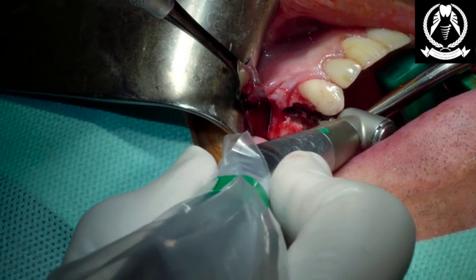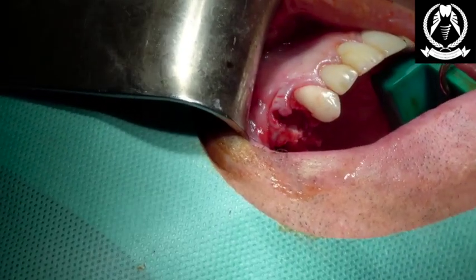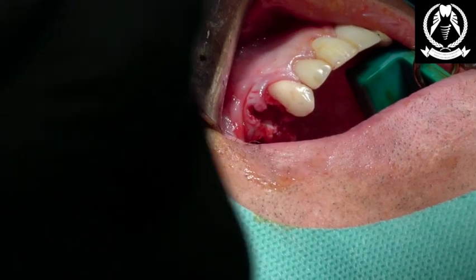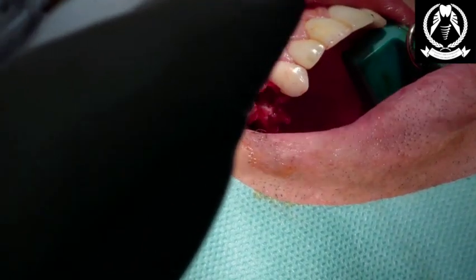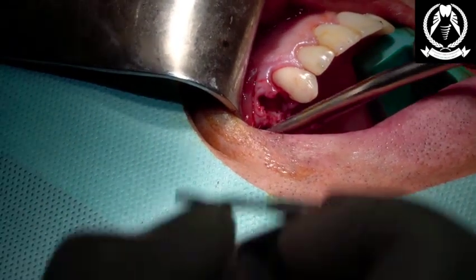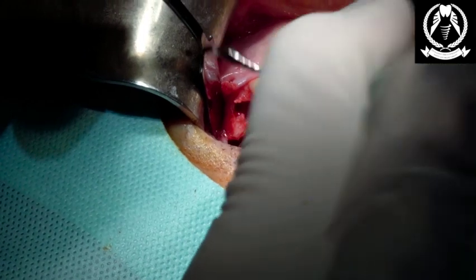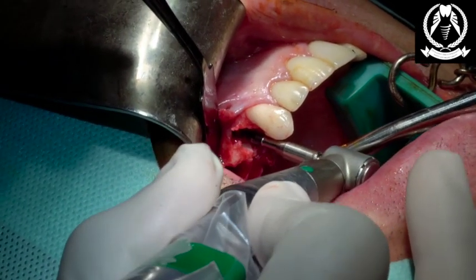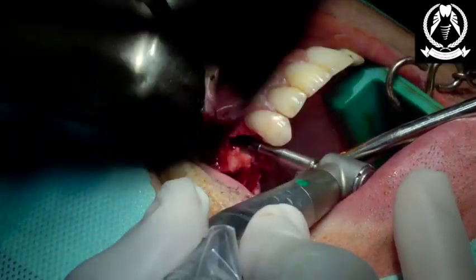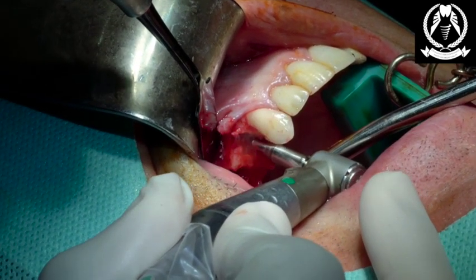See, we're knocking that tooth. So, a common issue with a long canine: you need to get deeper, you're knocking the tooth, yeah? So what you need to do is get back on that drill extender, get the patient opening wide enough to get away and get into the position that we want this implant. Implants are planned in the prosthetic. Open again, Alan. They really stretch you for a minute, okay? Try to get in the socket, position where we want to position, yeah? Check that all out. Amazing.